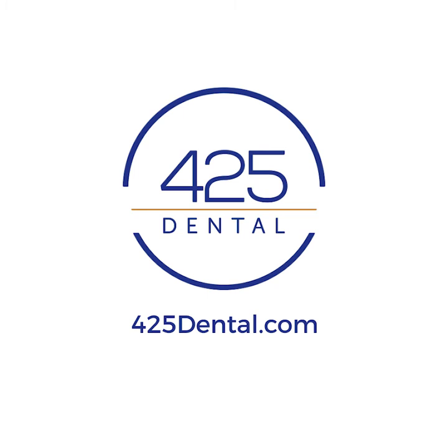We have provided you with a small nail file to smooth out any rough edges on your aligners that were left behind from the manufacturing process. If any sores develop on your tongue or cheeks from the aligners, please use a warm saltwater rinse 2 to 3 times daily to help heal and toughen up these areas in your mouth.